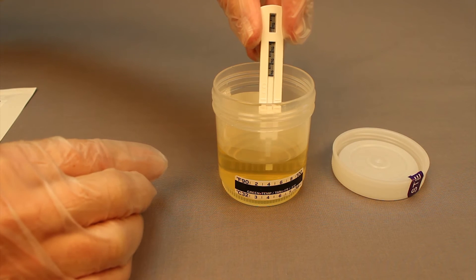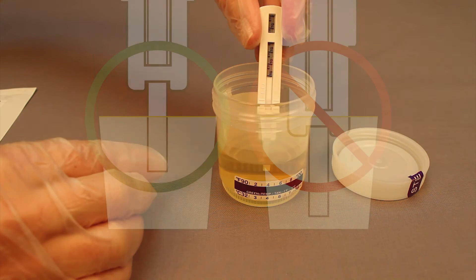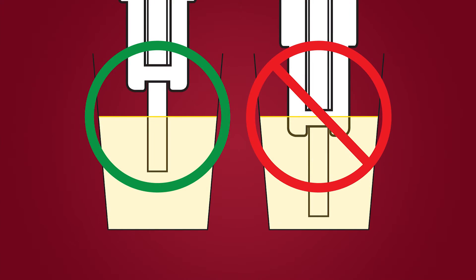Immerse the sampling tip of the test strip in the urine specimen for 15 seconds. The plastic cassette should not touch the specimen.